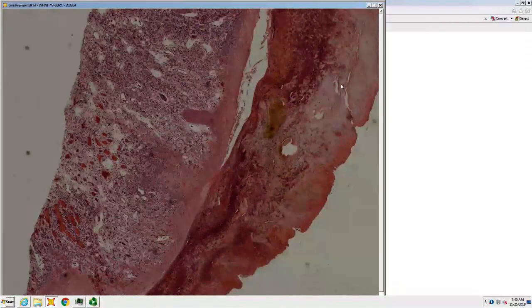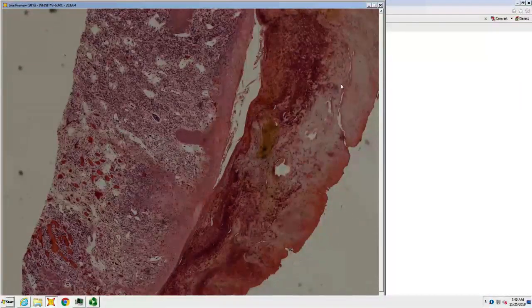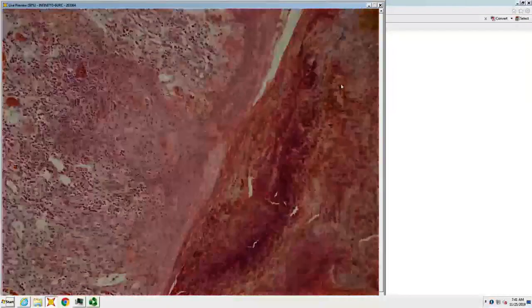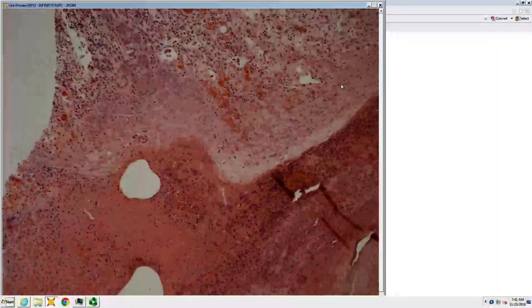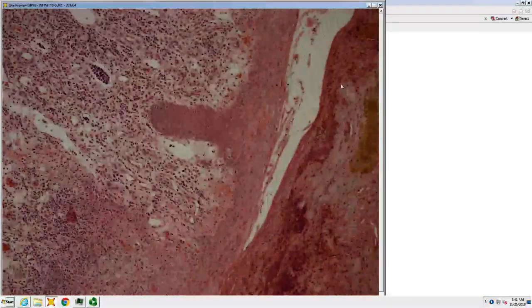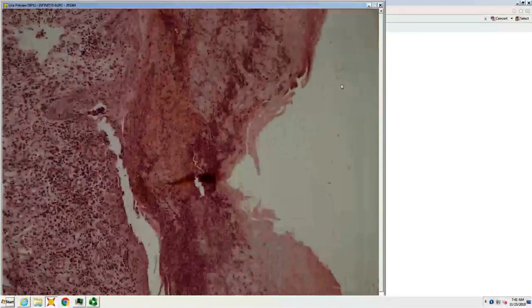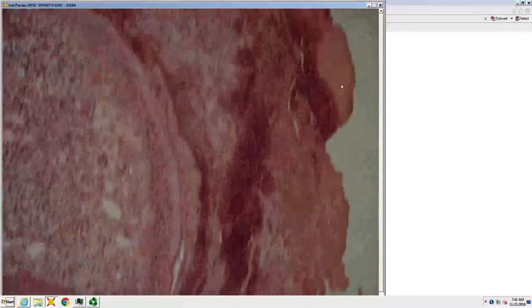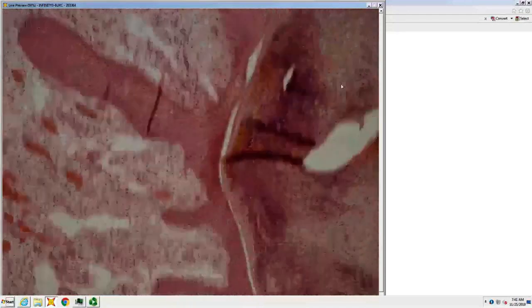There's a lot of inflammation in the dermis, and then a lot of scaly crust. Big crusted lesion, elongation of the rete, kind of irregular pseudoepitheliomatous hyperplasia. Looks like an ulcer right there. Ulcer, granulation tissue. Is it more like parapox? Well, I'd certainly wonder about that, and I'm looking for eosinophilic cytoplasmic inclusions, which are not popping out at me, but the history was ORF.